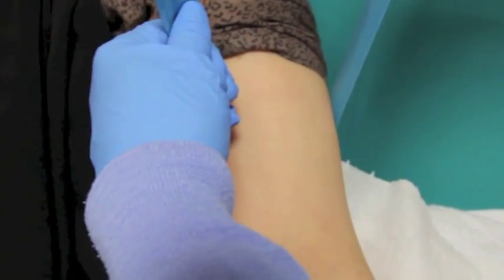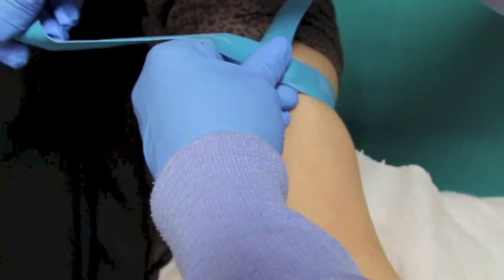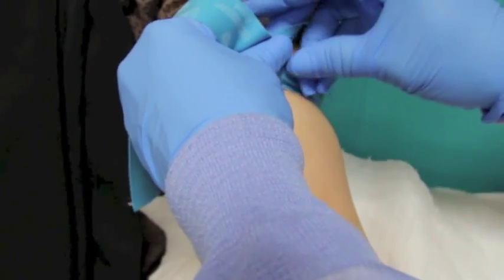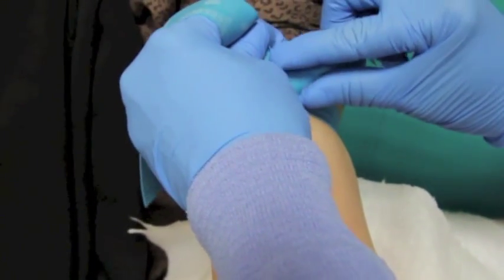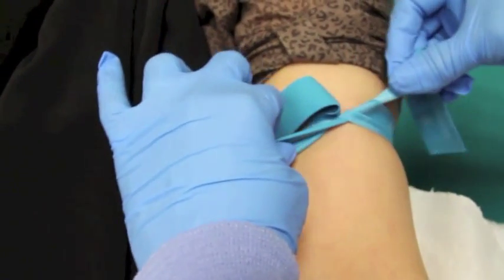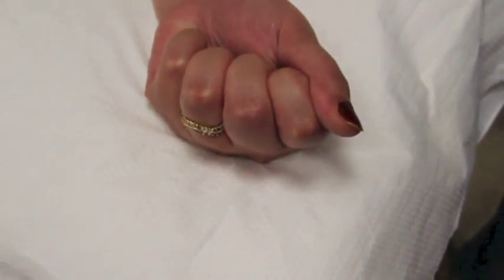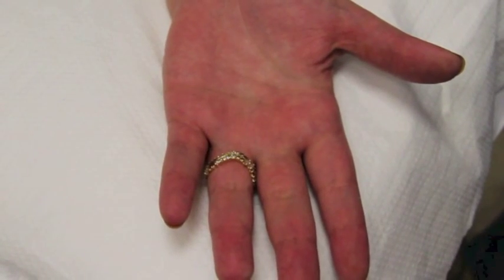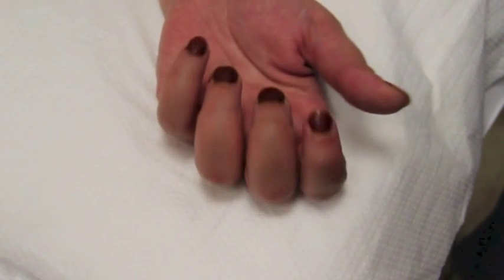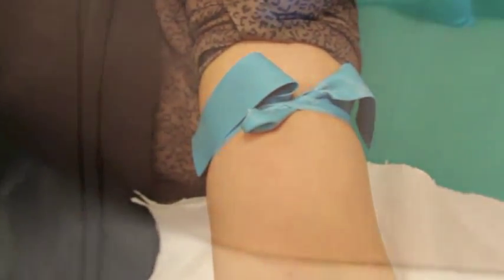The tourniquet is tied 10 to 15 centimeters above the phlebotomy site in a manner to accommodate single-handed release when necessary. This helps the veins to be palpated. Care should be taken to tie the tourniquet so that it is not too loose or too tight. The patient is requested to open and close the fist, which accommodates the veins to become more visible. The tourniquet may only be left on the arm for 1 minute once the procedure begins.